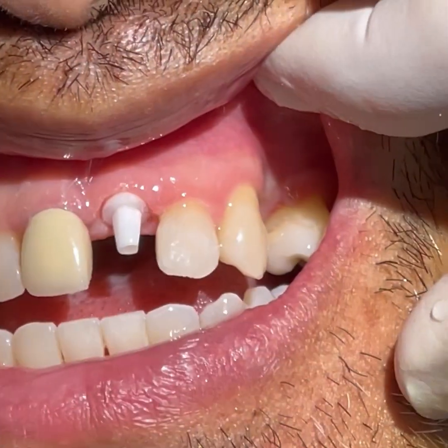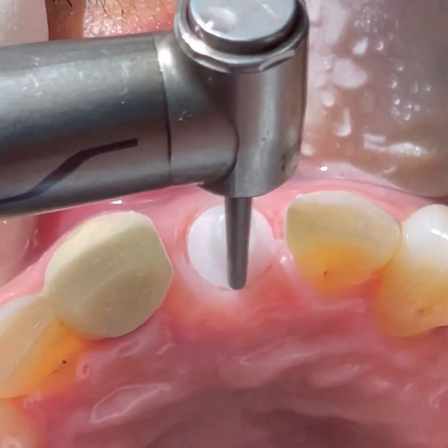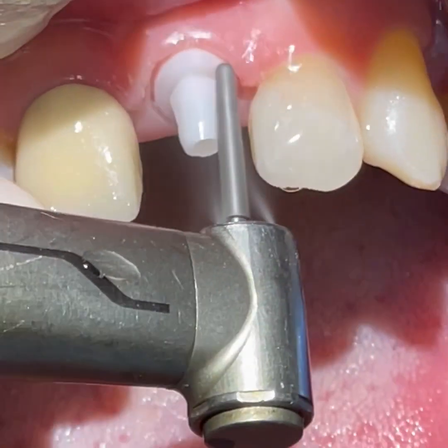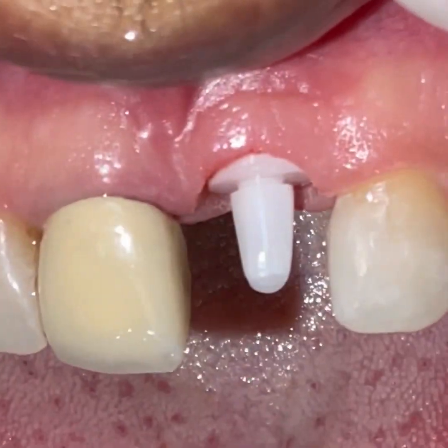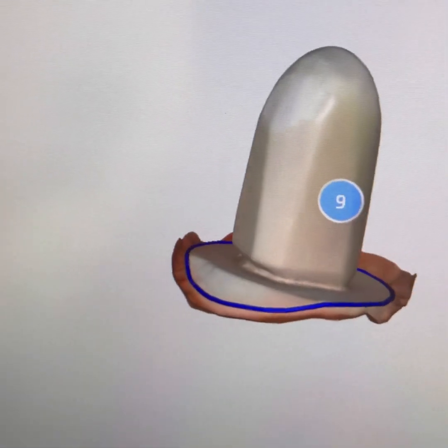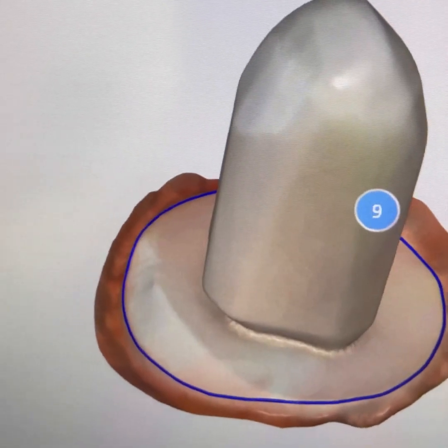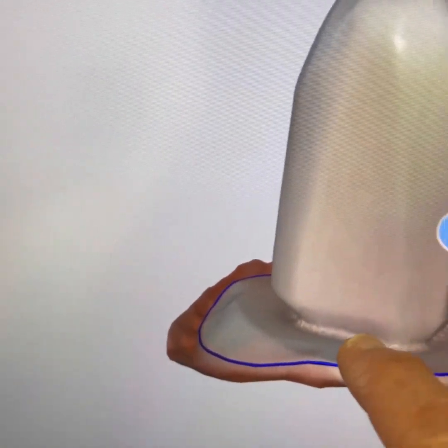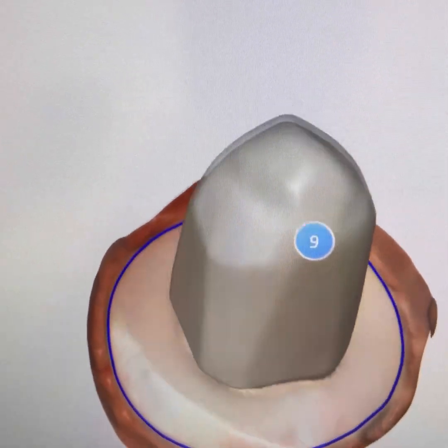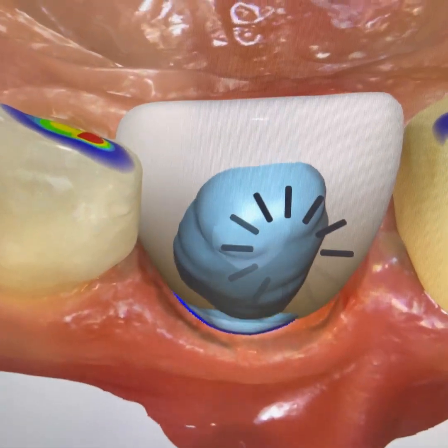In prepping the abutment again with a new red-striped diamond and light forces, I'm also creating some flat faceting to introduce anti-rotational elements. The implant is now ready to be scanned with my CEREC scanner. Introducing a bevel especially on the facial side of the implant not only reinforces the anti-rotational factor for the crown, but also creates a smoother transition in the visible area and follows the contour of the gingival margin.